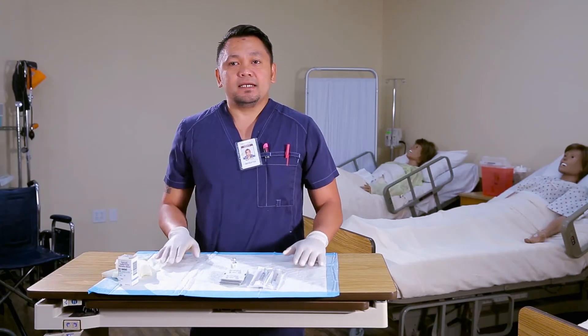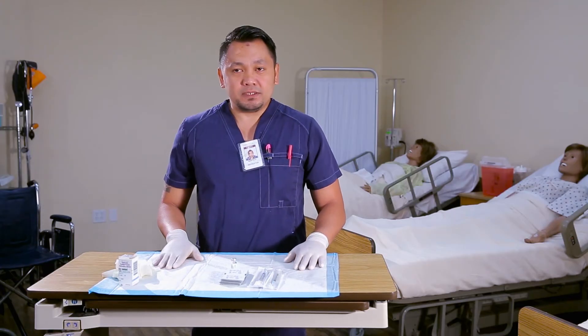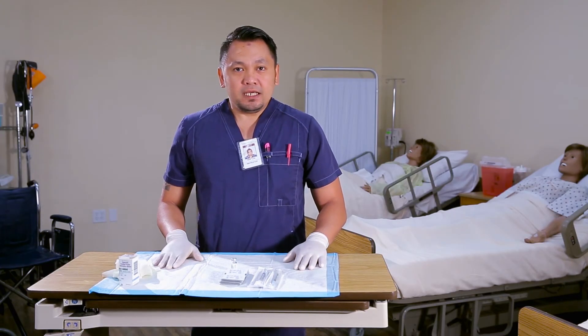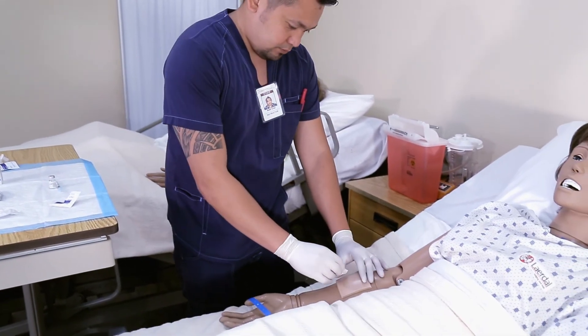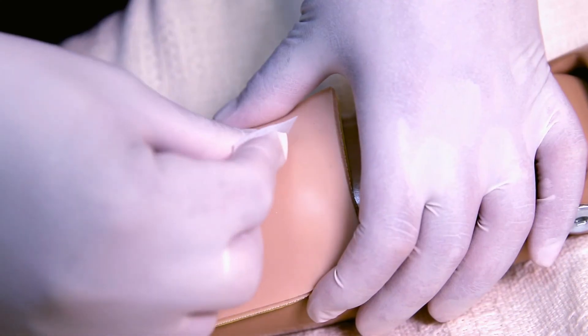Assist the client into a comfortable position, clean the site with an alcohol pad, and remove the cap from the needle.